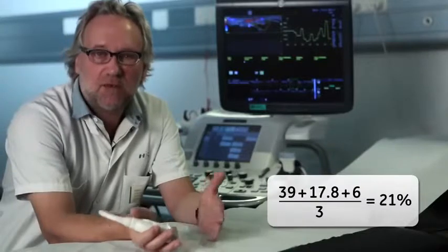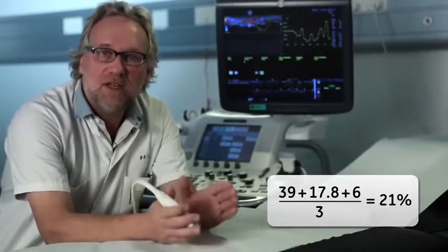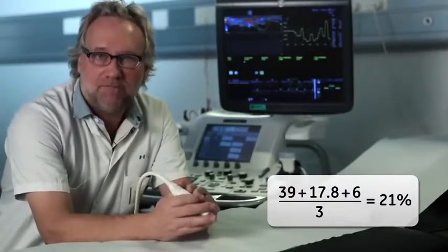Now, had she, for instance, had lower color fraction than 21%, but let's say 6% today, I would have re-injected her wrist based on that information. Only by using color Doppler quantification will I be able to measure this decrease in activity. So because of color Doppler, we are able to compare the disease activity before and after treatment and measure the results of the treatment. The use of color Doppler is a very beneficial development in the treatment of rheumatoid arthritis.